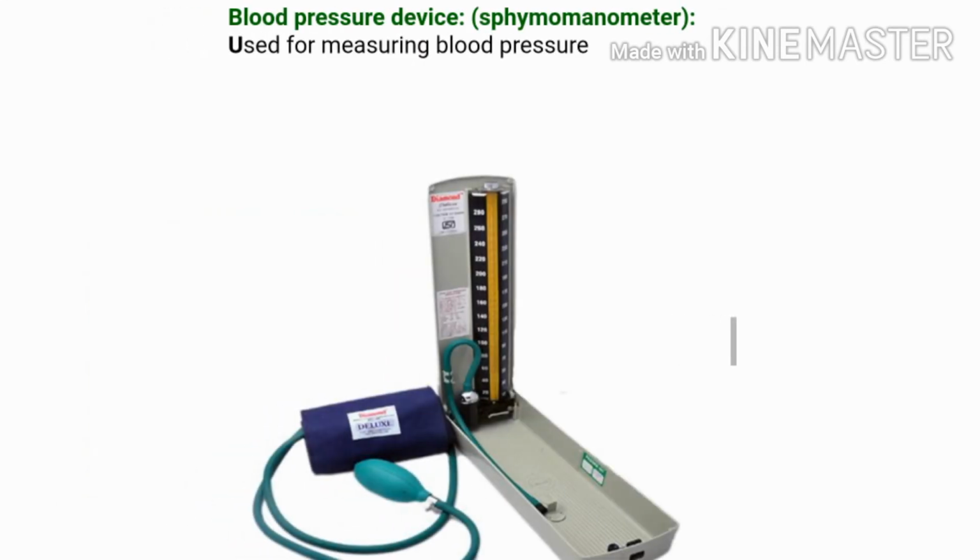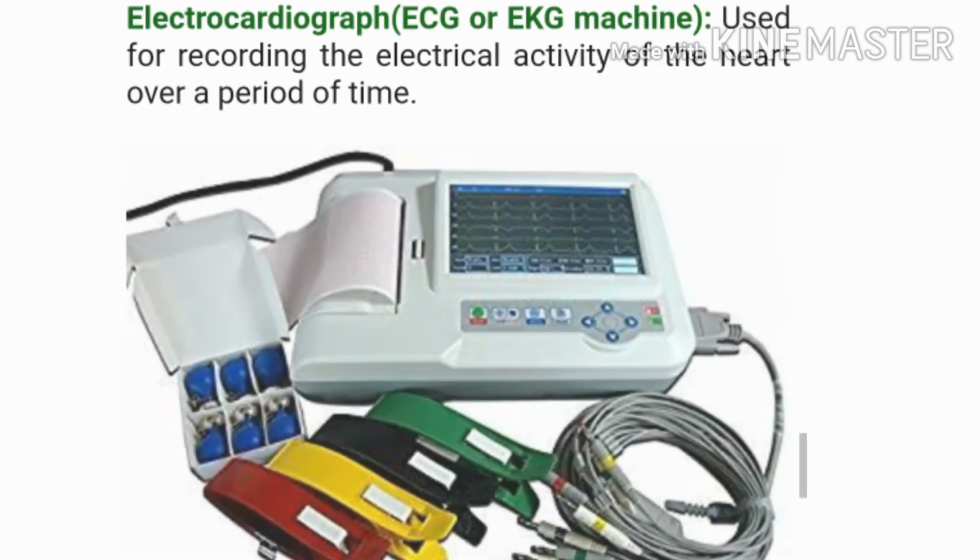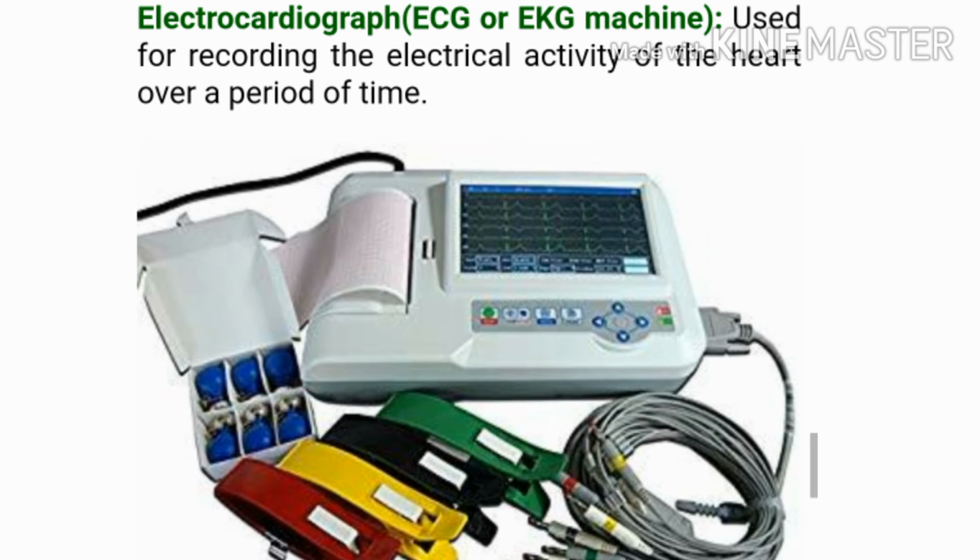So this is the blood pressure device known as a sphygmomanometer, and as the name shows, it is used for measuring blood pressure. You can see the image very clearly. And this is the image of the electrocardiograph, ECG, or you can say EKG machine. It is used for recording the electrical activity of the heart over a period of time. So this is all about the electrocardiograph or ECG machine.